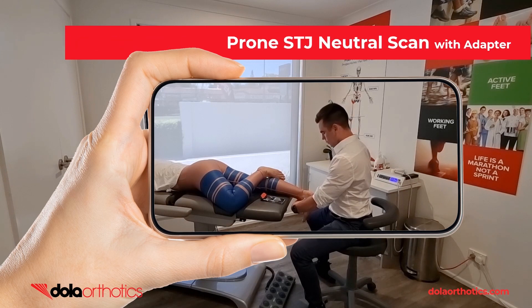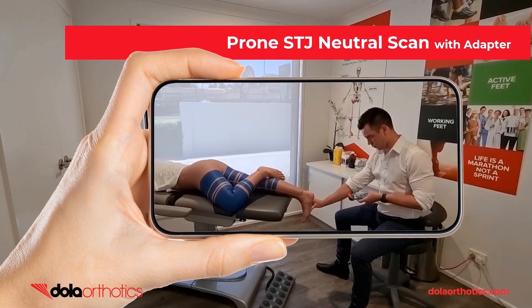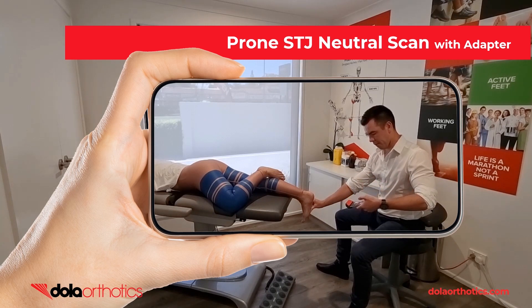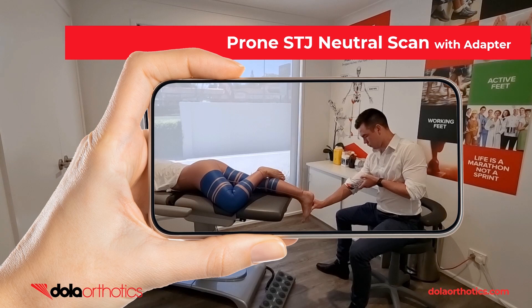Here is a demonstration of the iPhone with the Dollar iScan adapter being used to scan the foot with the patient prone, often seen in health practices, sporting or gym settings or mobile clinics. The clinician is able to hold the foot in subtalar joint neutral just like completing a traditional prone plaster cast while completing the scan. The adapter provides easier visualization of the screen during the scanning process, allowing the clinician to remain seated.